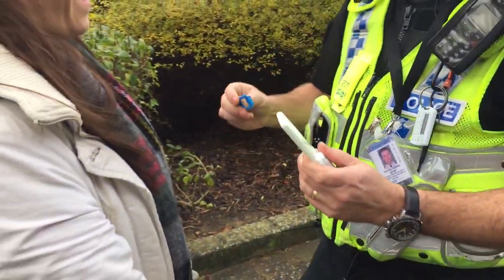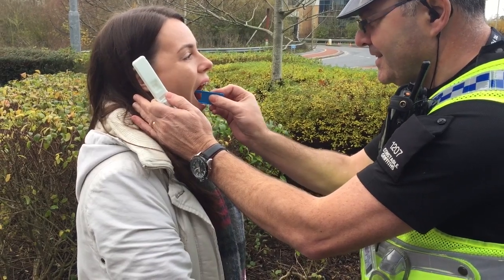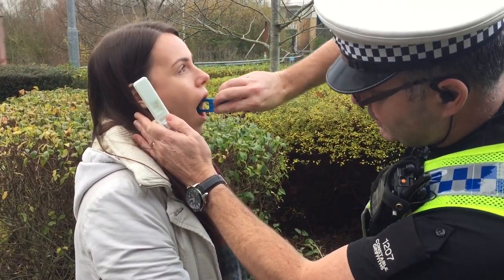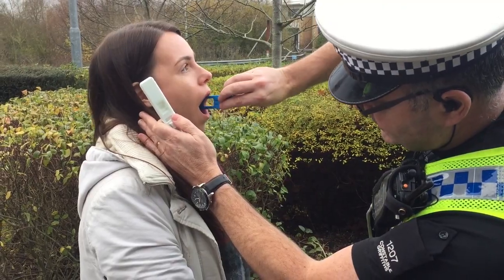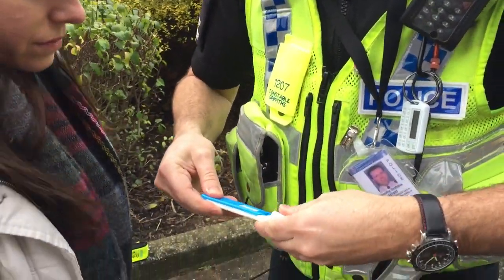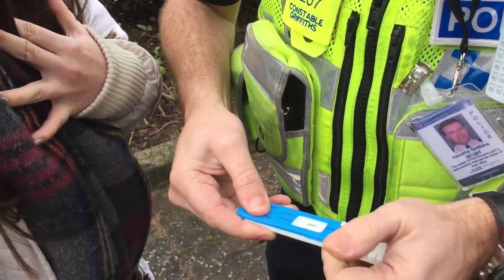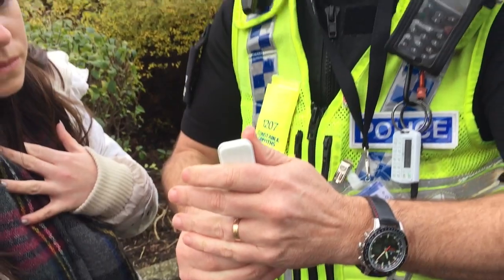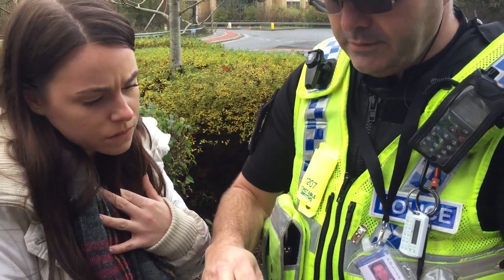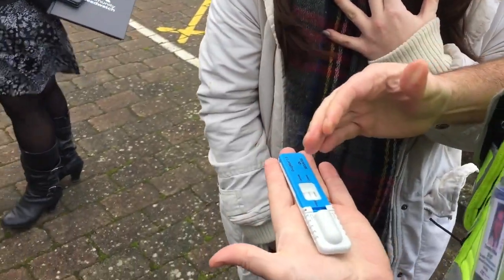When you're ready, open nice and wide. Push it down. And the right-hand side. So it goes back into here — crack open the vial. You can hear it cracking. So close it, a couple of seconds at the top, seconds at the bottom. And then we make a note of the time: 11:06, and we leave it for eight minutes.